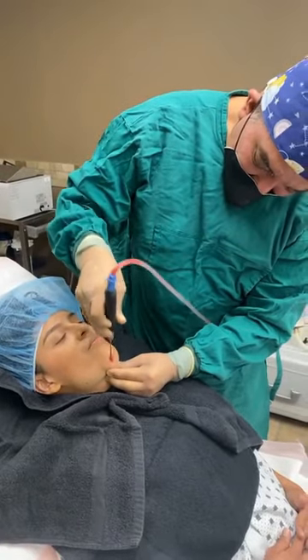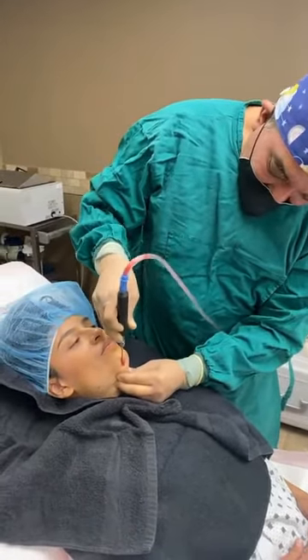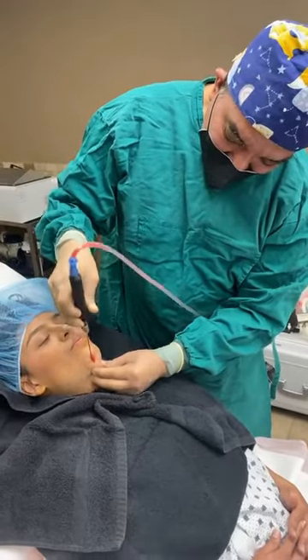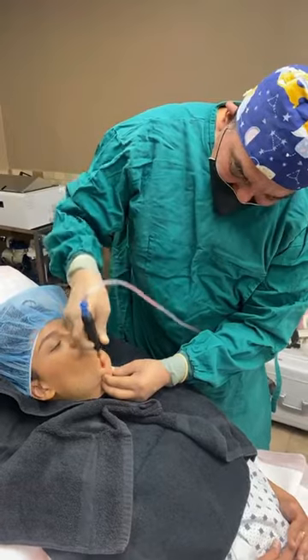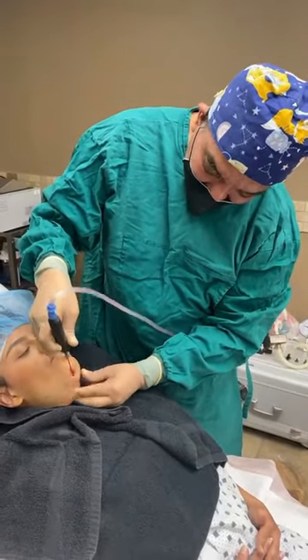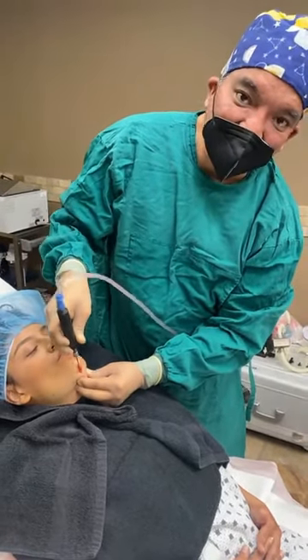Somebody wants to know if you will show how much fat you get. There's only going to be less than 10 cc's. You can see it right here in the cannula. There's a little bit of blood, but it's less than 10 cc's, believe it or not. Now remember, a filler, which is something that you put in your lip, is only 1 cc, yet it enhances the appearance of your lip. Now in her case, it's less than 10 cc's. There are going to be patients that want significantly more removed, and generally I'm seeing somewhere between 10 and up to 50 cc's.